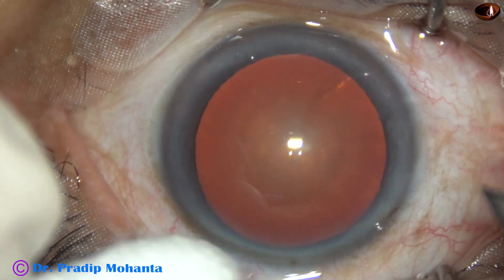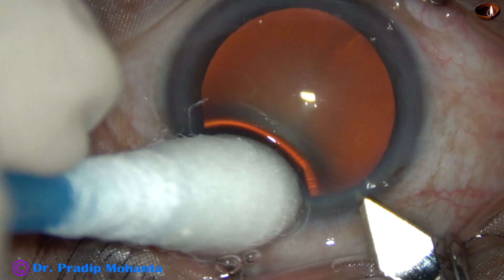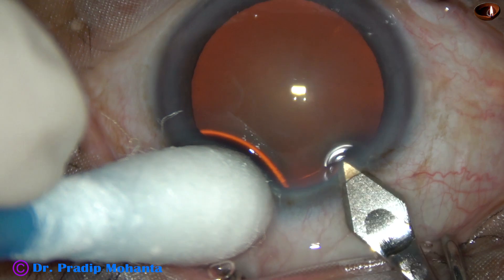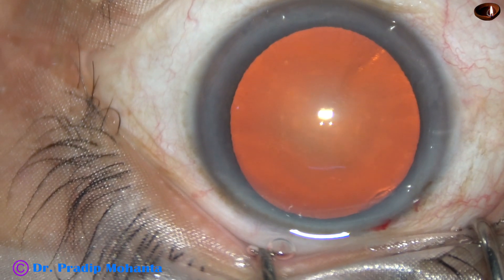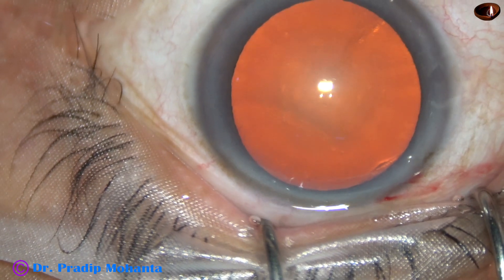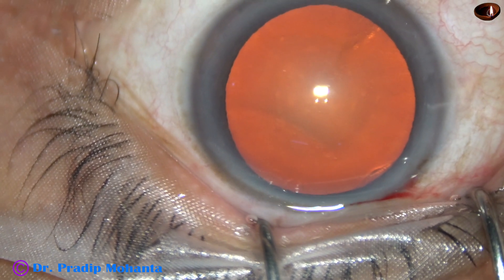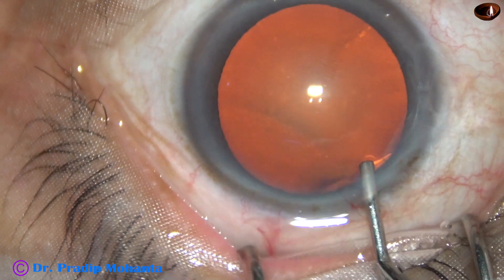This is the main incision with a 2.8 mm keratome on the posterior aspect of the limbus. 2% hydroxypropylmethylcellulose is injected through the incision to fill the anterior chamber — 2% HPMC, here it goes.